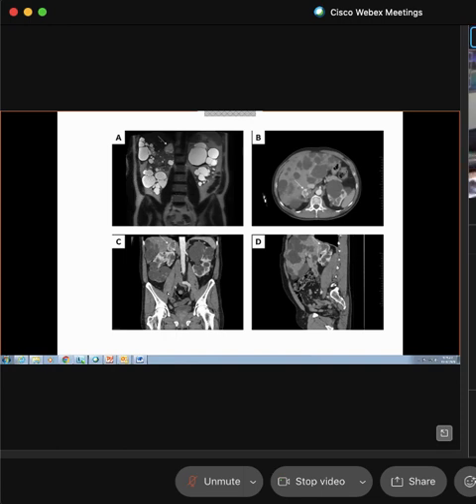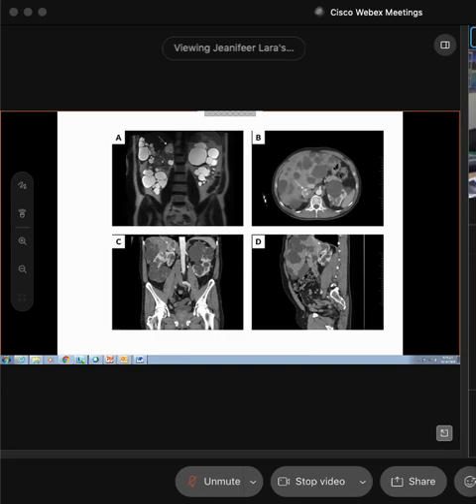So here we're able to see, what is this image of? What does this look like? Thank you, John. What is this anatomy? Psoas. Thank you, John. Psoas muscles. And then we're also going to see some type of vessel. Here we have the aorta. Okay, great. You guys did an awesome job.